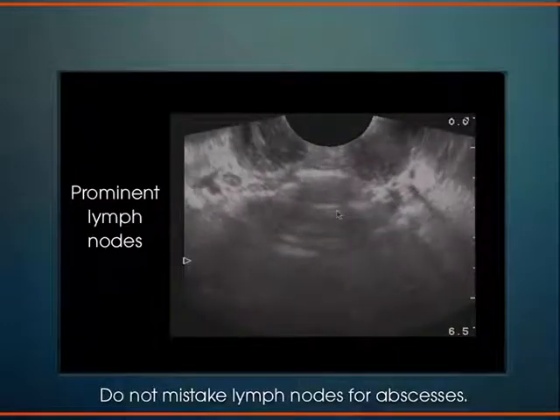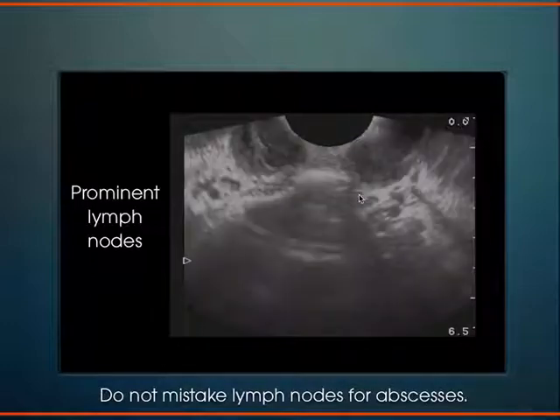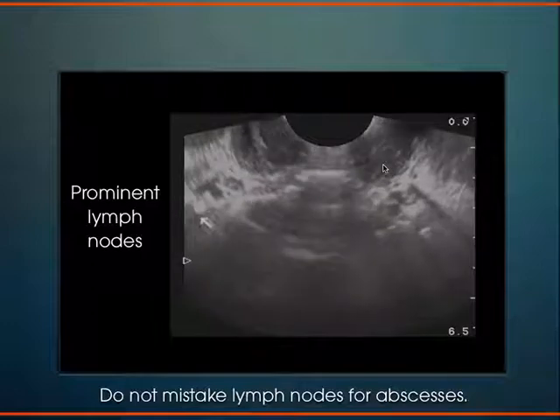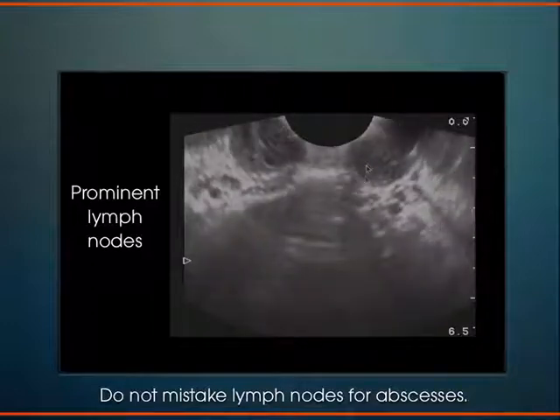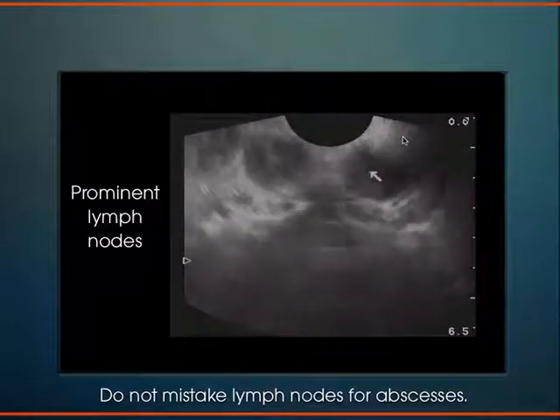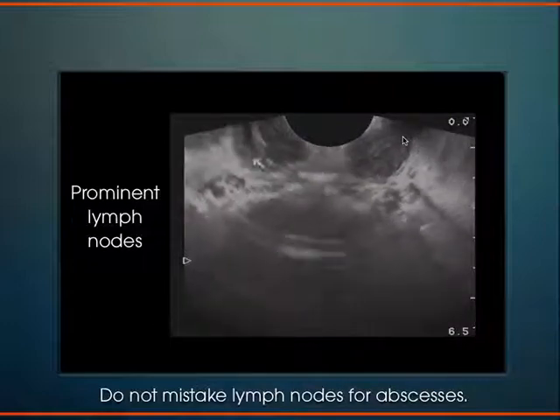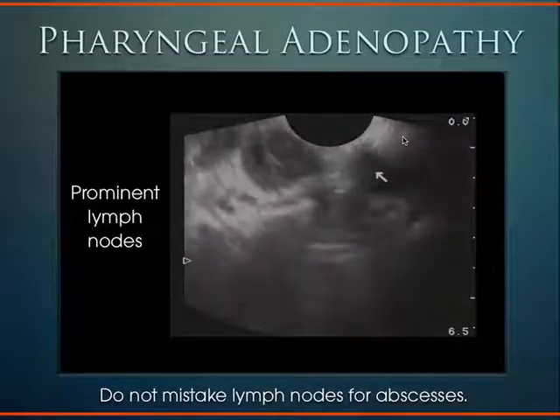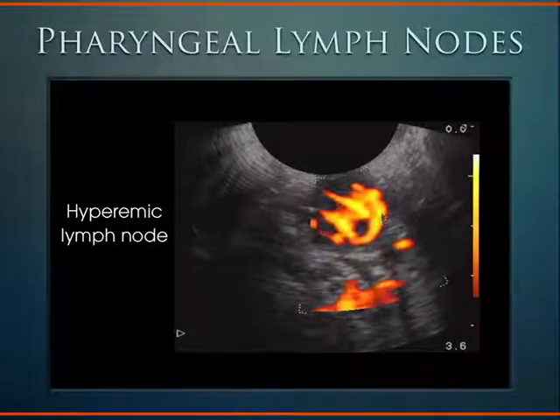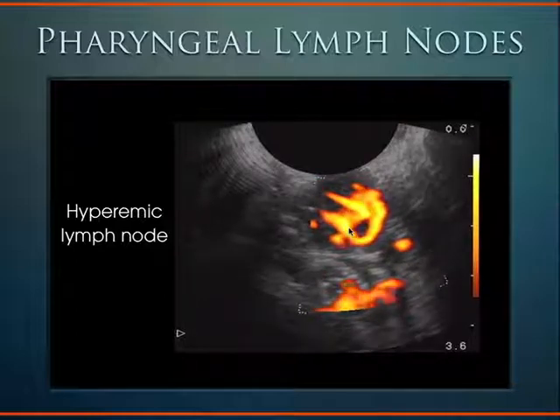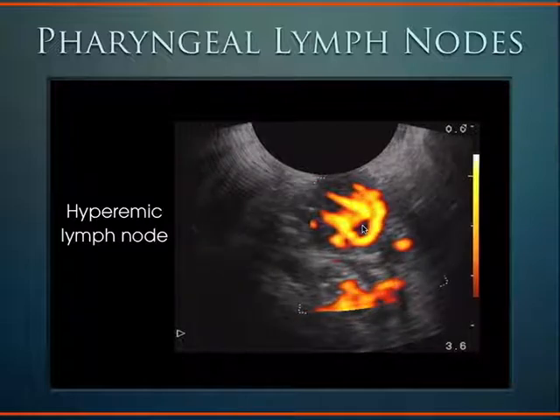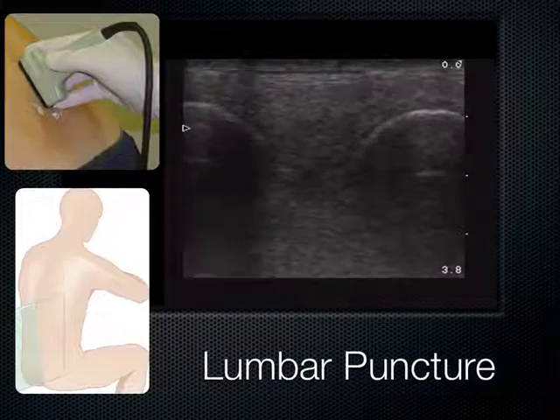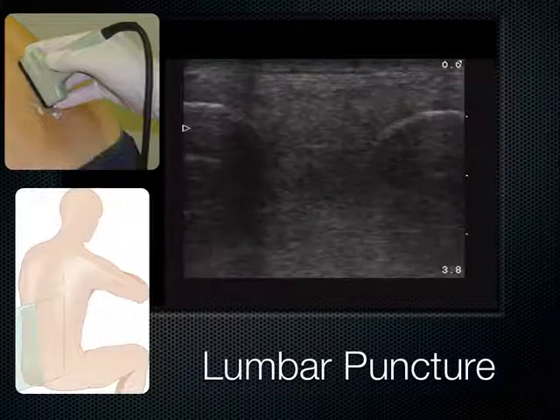Sometimes you're not sure if it's an abscess — it turns out these are just prominent lymph nodes. As the patient swallows, you'll actually visualize the lymph nodes moving toward each other. These are bilateral prominent lymph nodes — you wouldn't want to put a needle in those unnecessarily. Once you see pharyngeal adenopathy, you can confirm it's a lymph node using power flow Doppler. Lymph nodes can be quite vascular, and this hyperemic lymph node lights up with power Doppler confirming it's a lymph node and not an abscess. An abscess would not light up with power Doppler.